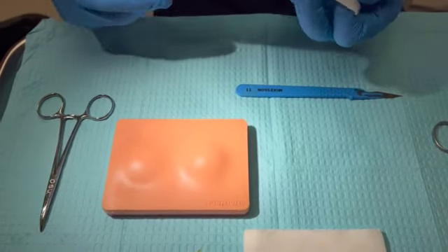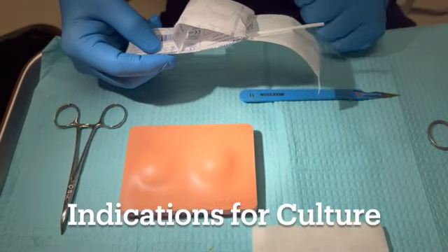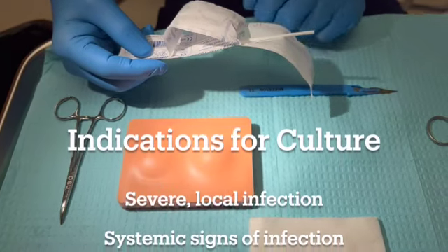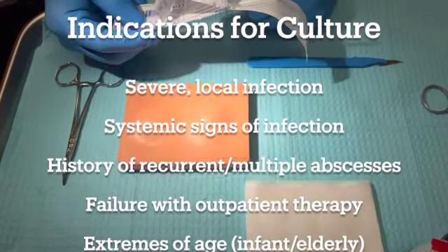We'll demonstrate how to obtain that culture today. Indications for getting a culture are if we do have a severe local infection, if there are systemic signs of infection, thinking of fever or potential hypotension or other signs that can be present.